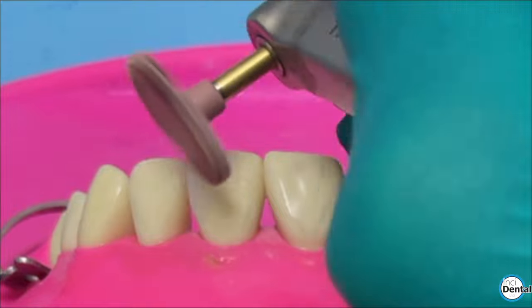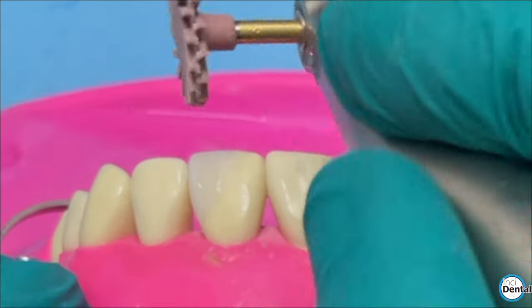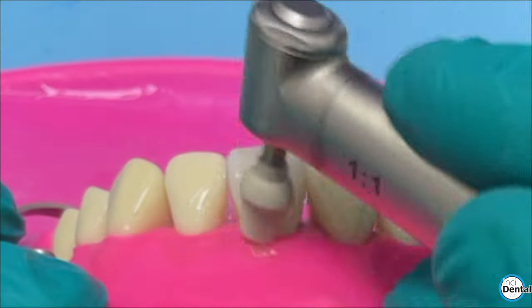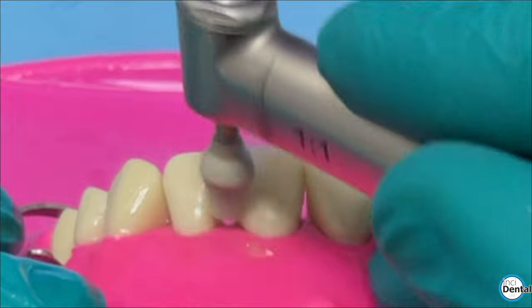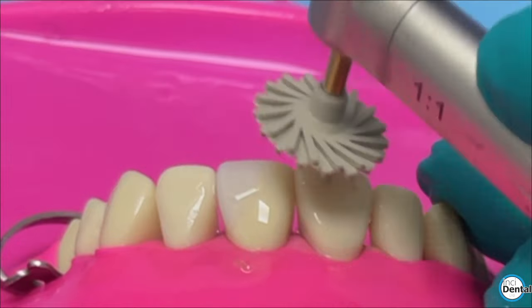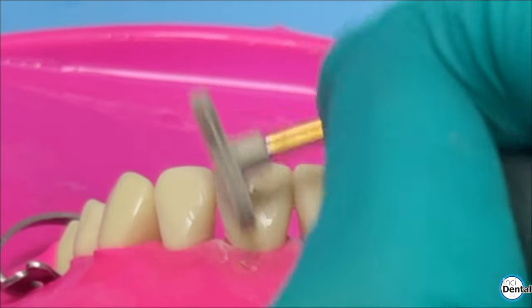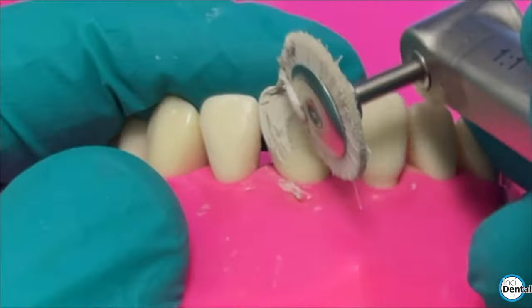For the twist, I use it dry — if you use it wet it just goes everywhere — pecking at the tooth at quite a low speed, eight thousand RPM is best. Nothing quite gives a finish like those twists do. That's the medium grit Ocloflex from EVE. Now we go to the white, which is the fine grit. These give an incredible polish — most of the time I use that as my final polish, and only when getting really fancy do I go any further. Again, Ocloflex with water on and then dry, and for the twist.